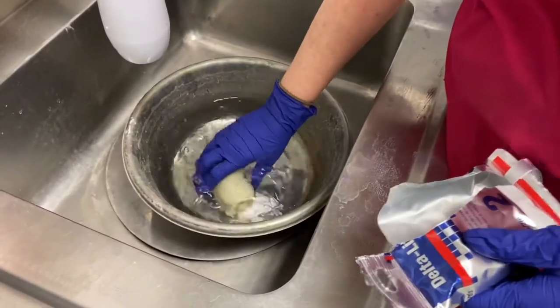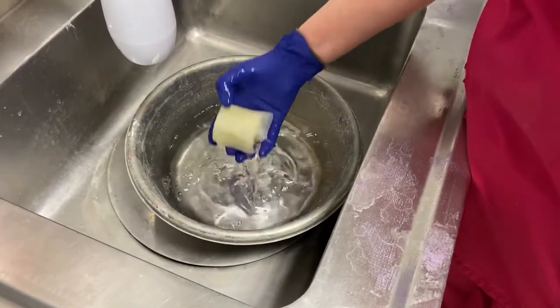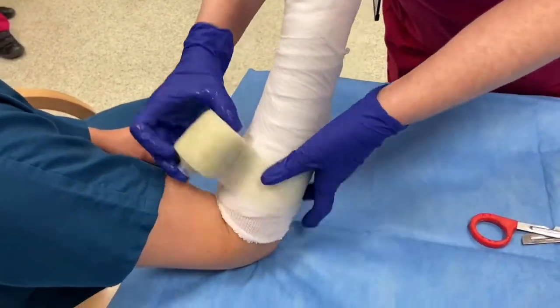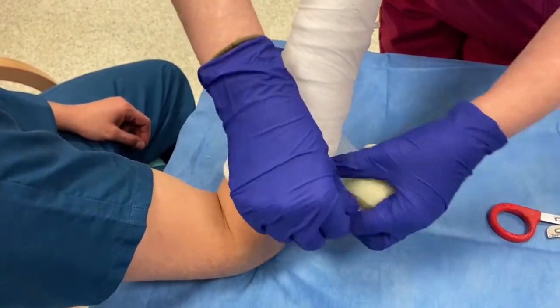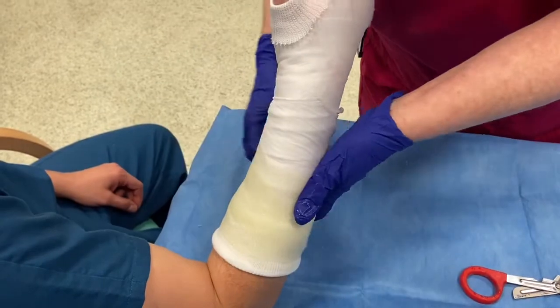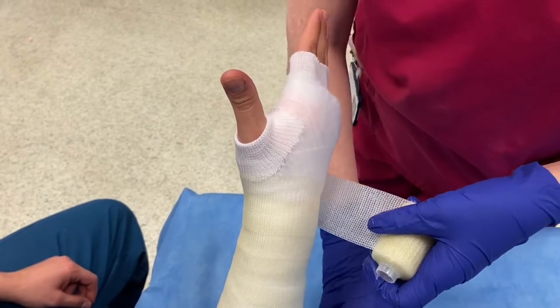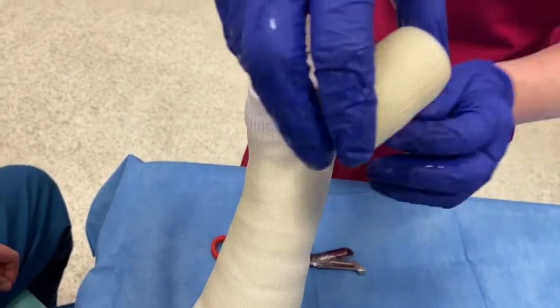Once everything is ready, the fibreglass bandage is taken out of its waterproof wrapping and dipped in cold water. If the water is too warm, the bandage will set too rapidly and you won't be able to complete the cast. In the forearm, the cast is started about two finger breadths below the elbow crease. This enables the padding and tubigrip to be folded over the first layer of the cast, padding it nicely at the elbow. The cast is then wrapped around the forearm, overlapping by 50 percent on each turn. A little bit of tension is applied to enable it to lie snugly, but it is essential that it's not pulled too tight, causing any pressure points or constriction.